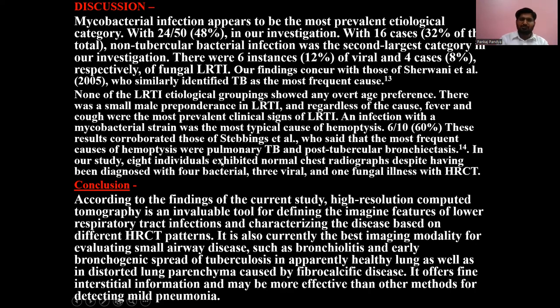In our study, 8 individuals exhibited normal chest radiographs despite having been diagnosed with 4 bacterial, 3 viral, and 1 fungal infection on HRCT. So HRCT is superior to chest X-ray. According to the findings of the current study, high-resolution computed tomography is an invaluable tool for identifying the imaging features of lower respiratory tract infection and characterizing the disease based on different HRCT patterns.